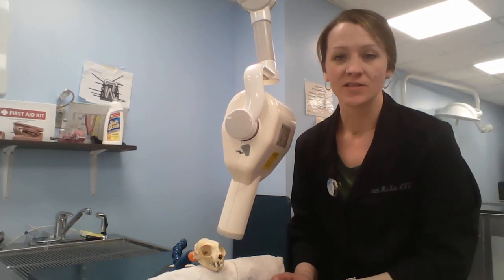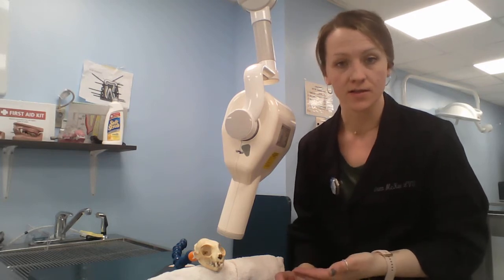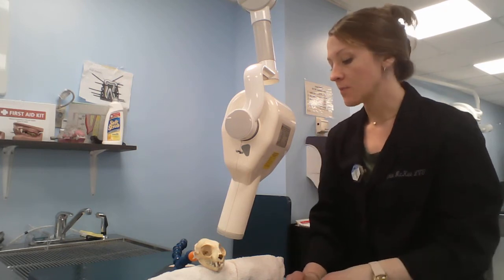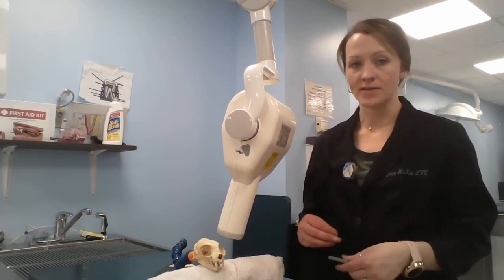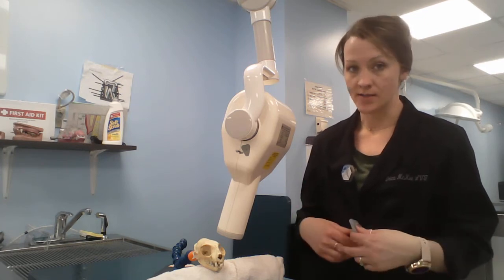Hello, I am here today to show you how to do feline dental x-rays. Feline dental x-rays are very similar to what we've shown you so far in canine dental x-rays. The big difference is they have fewer teeth, so there are fewer views to take. Same techniques are going to happen. We're still going to do the bisecting angle technique pretty much everywhere, so finding your angles and then bisecting that in half.